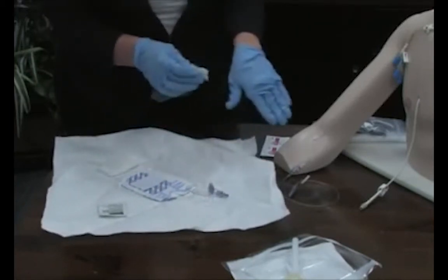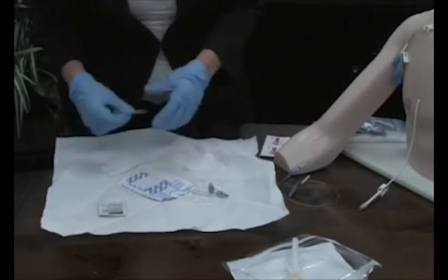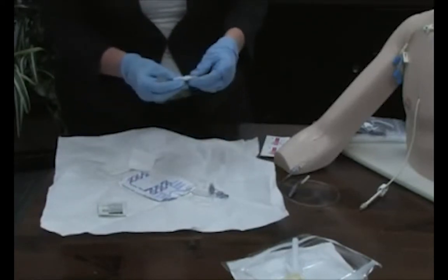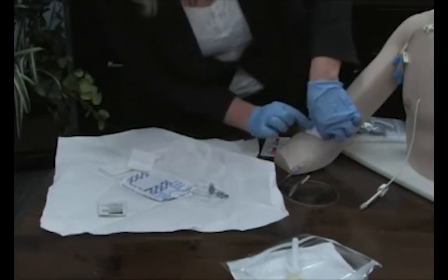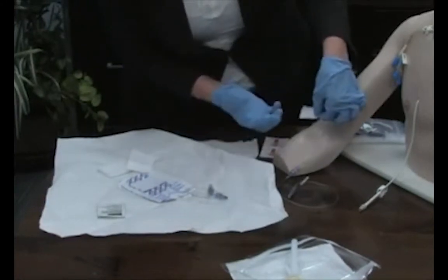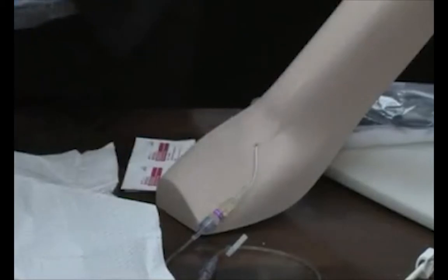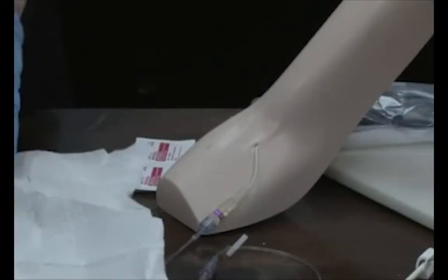Let's say you have a patient with a PICC line that does have some drainage there and you're concerned about it and you want to wick it away. The technique for that is to fold your gauze in half. And when you apply it, you want to put it a little bit above the site to where it literally wicks it away. You don't want to put it on it where it literally just sits there. If you put it a little bit above, it will actually draw it from the site. But we're not going to use any gauze.